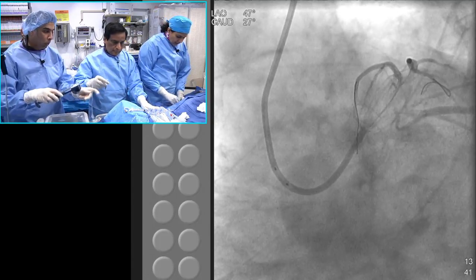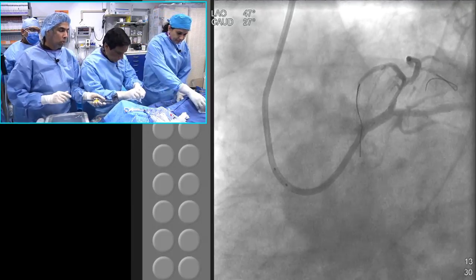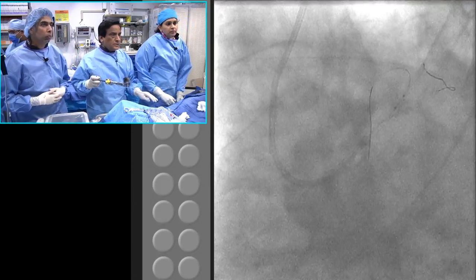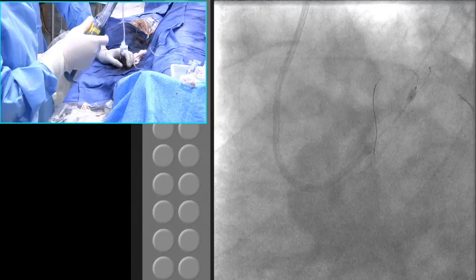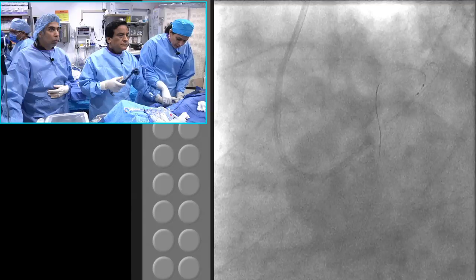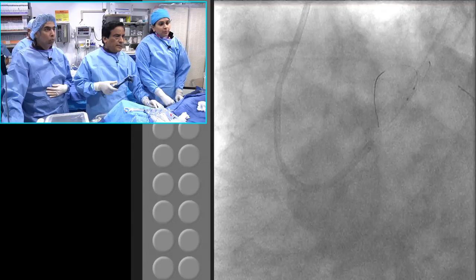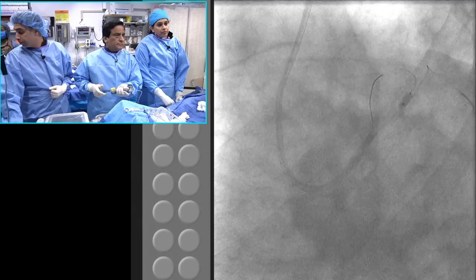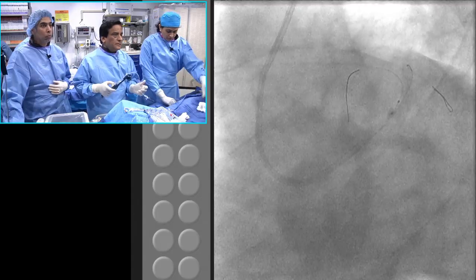So we are using the same Flextome for the LAD. And you saw that we did 2 cuts and come back, so basically the blades are in different directions. And this is also another question that is always raised: you have a wire in the side branch, can you use a cutting balloon, especially Flextome, with the blades in the main vessel? This is allowed, what you demonstrated, you could. You cannot do rota, but cutting balloon, chocolate balloon, AngioSculpt, yes, can be used.